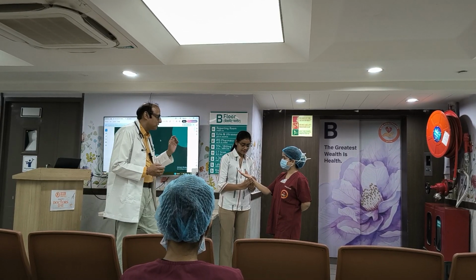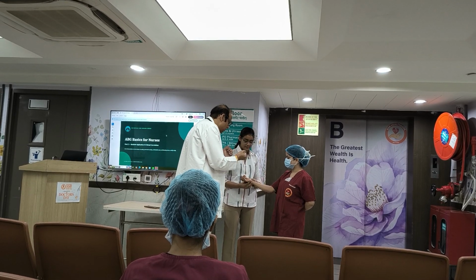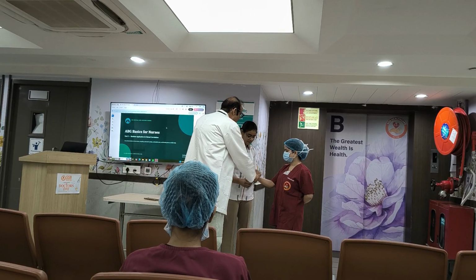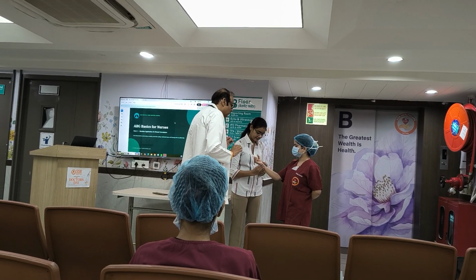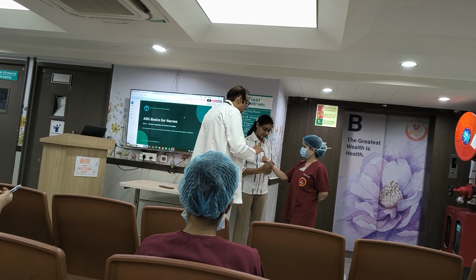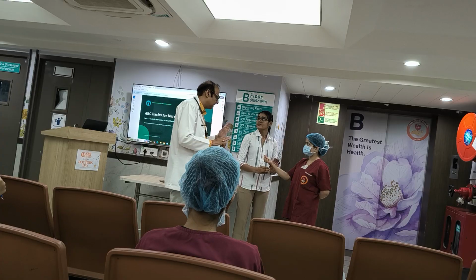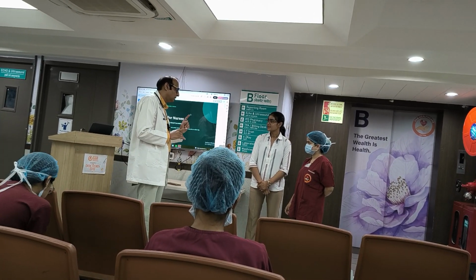And then first, what do you want to do? Both, like, fist your hand like this. आप ऐसे करो. ये पहले दोनों को वो करो first. Remove this one, the radial artery, and then fist. First we release one. Okay, that's fine. Ulnar artery is working. Awesome. Both radial and ulnar artery are working. That's the Allen test. Then you can perform ABG.